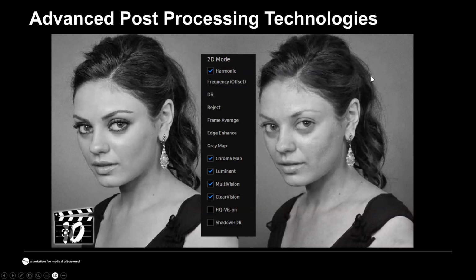So this is the girl who just woke up in the morning, so nothing really tells us that she is a film star. But once she goes through her morning and puts the makeup on, this is where we can see that this is a real star. So all those technologies of the post-processing, including those which are highlighted here, and we are going to expand a little bit more on the next few slides, help us to do pretty much the same with our ultrasound image. It can be used live, but it also can be used after you push freeze, and that helps us to improve the quality of the image.